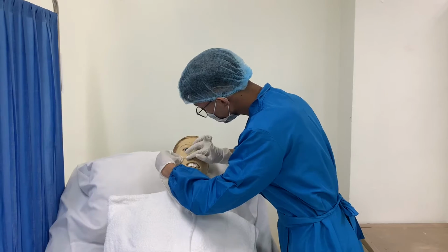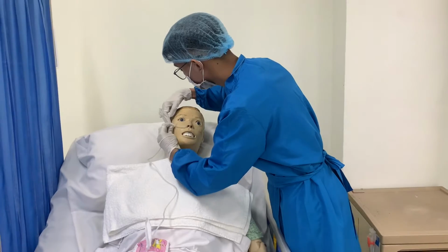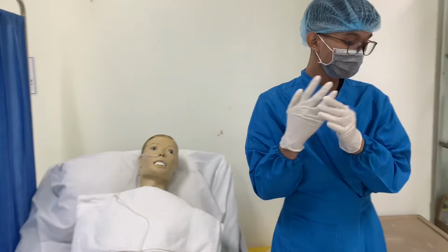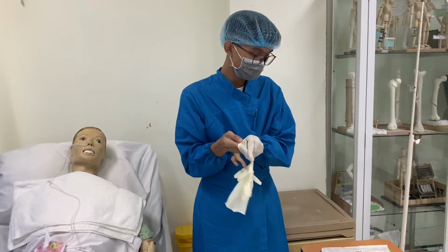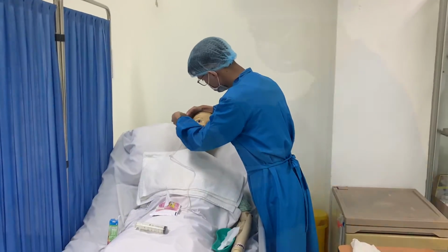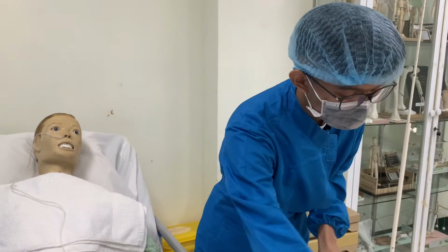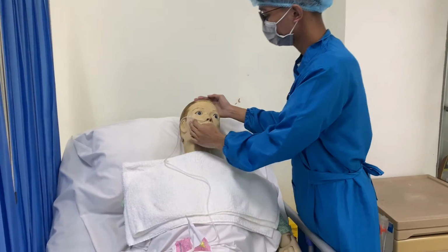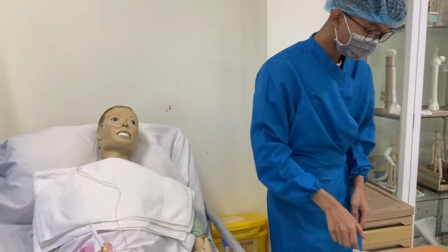Apply skin barrier to the tip and end of the nose and allow to dry. Remove gloves and secure the tube with a commercially prepared device or tape to the patient's nose. To secure with tape, cut a 4-inch piece of tape and slit the bottom 2 inches, or use packaged nose tape for any tubes. Place the tape over the bridge of the patient's nose. Wrap the slit ends under the tubing and up and over on the nose. Be careful not to pull the tube too tightly against the nose.